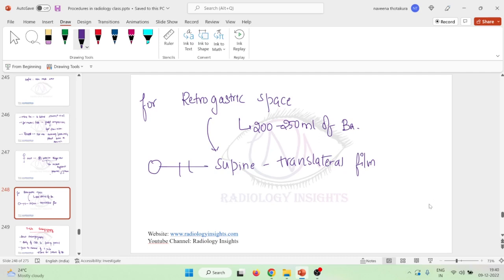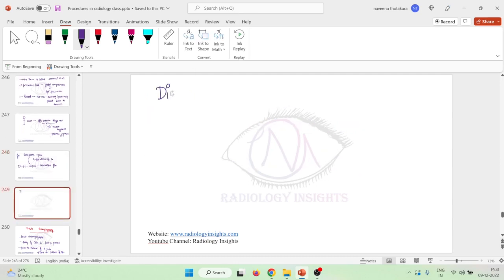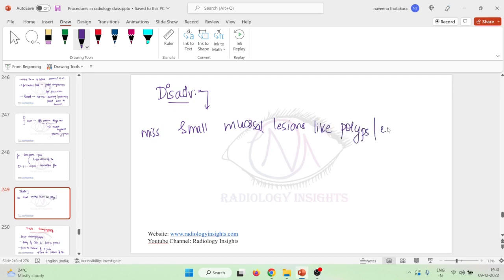Okay, this is important. These things we can see in single contrast film. But what is the disadvantage of this single contrast study? The main disadvantage is that the single contrast study will miss small mucosal lesions like polyps, or if there are any early carcinomas. So small mucosal lesions like polyps and early carcinomas are missed by this single contrast study.